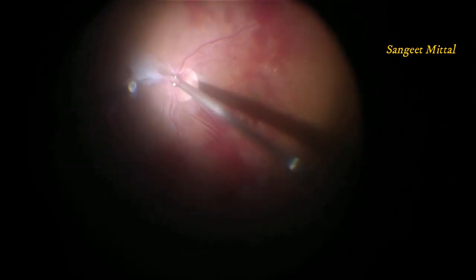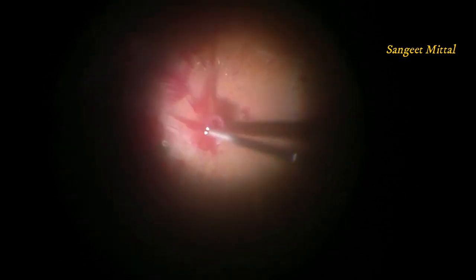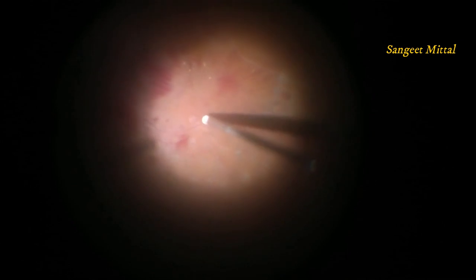This is another case in which a modified en bloc dissection was done. All pre-retinal membranes were peeled, dissected and removed. A very thin innocuous streak of hemorrhage was seen inferiorly in the mid-periphery. On teasing the membrane again, a layer of vitreous was revealed and separated from retina.